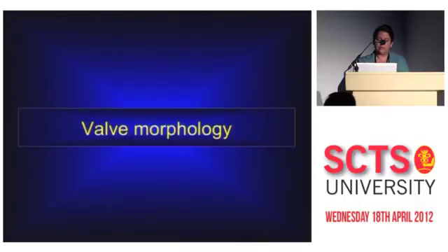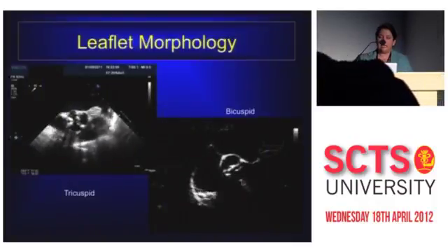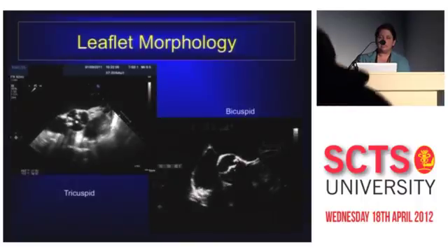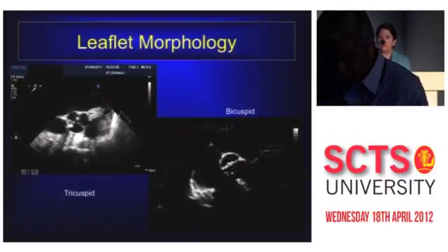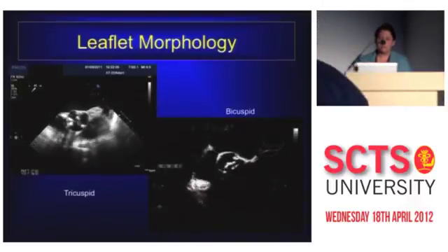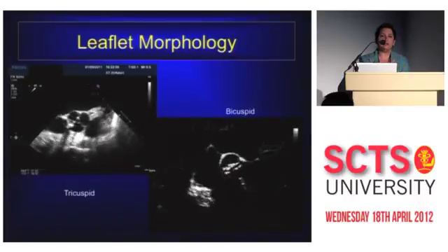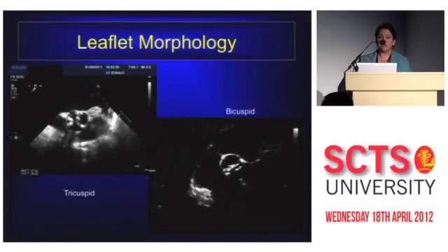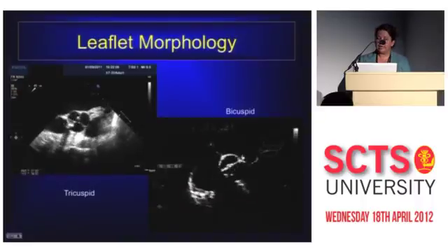Once you know that the annulus is of a size that you can actually fit a valve into, you do need to look at the valve morphology. And this is important, particularly if you're starting up a program, because I don't think a bicuspid valve is for startups. A nice tricuspid valve will allow wires, etc., to go through the middle of the valve, which is where the opening usually is. It's a central opening. But the orifice is very eccentric in a bicuspid valve, as you can see on the right-hand side of your screen. And the wire can be sitting very, very eccentrically.